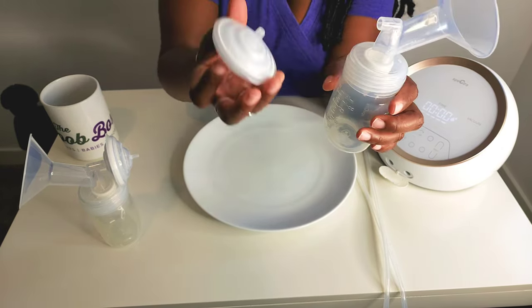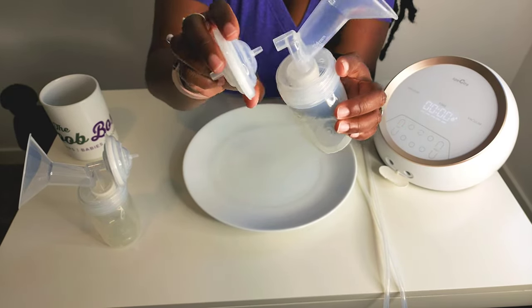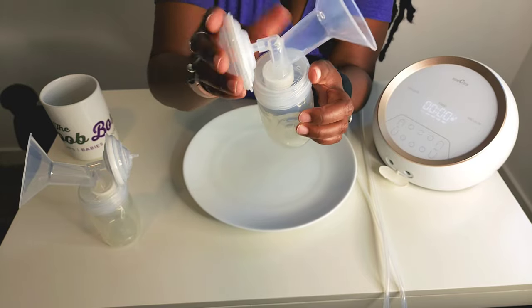Once you've done that, you're going to go ahead and attach your backflow protector to your flange, and it can only go on one way. So this is pretty easy. I love that Spectra did that. It makes it pretty simple to put on.